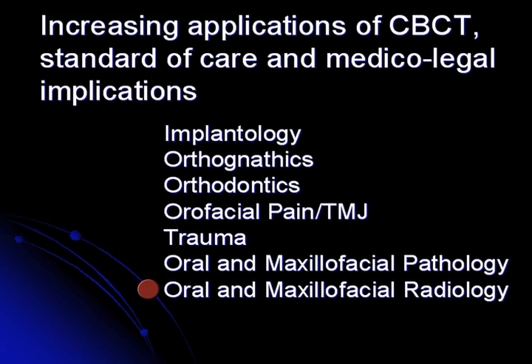Oral maxillofacial radiologists are more and more using this cone beam CT. It's becoming their primary bread and butter, if you will, of what they're doing all the time and what they're looking at and how they're taking technology forward in radiology is focused predominantly now on cone beam CT. So with that in mind, I want to go over some exemplars of some of these applications so you can see what kind of cases that we see and what the utility is.